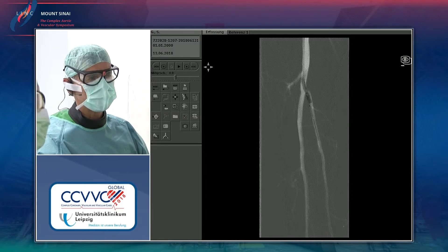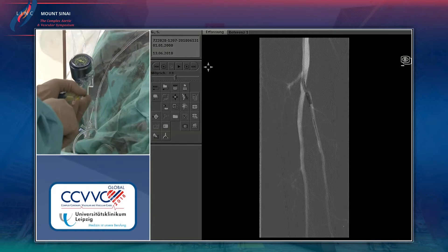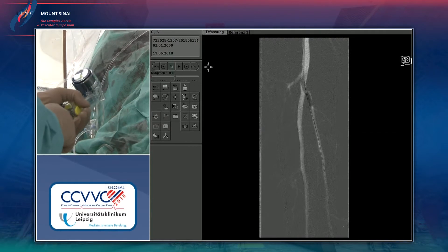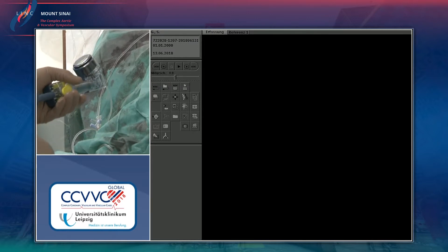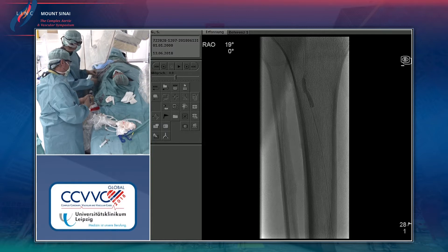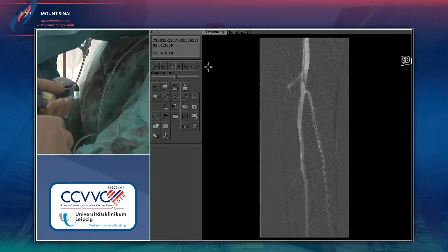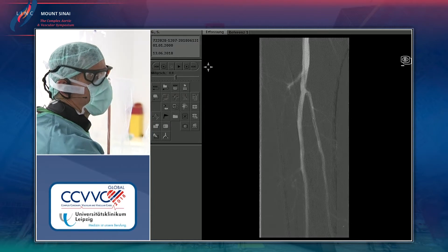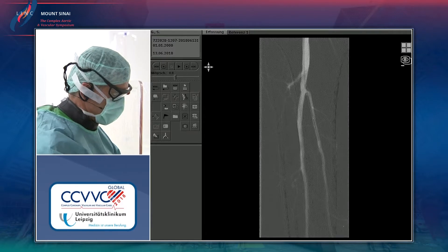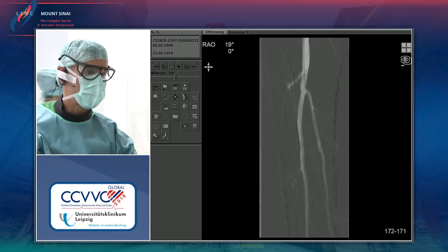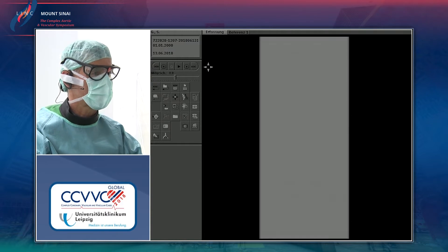A 3.5 mm balloon is tried — still not oversizing at this level. Maybe a 4 mm balloon is needed. A 3.5 mm is chosen first. The treatment plan after opening the artery will be drug-coated balloons — Plutonics — but first this resistant proximal stenosis needs to be cracked.